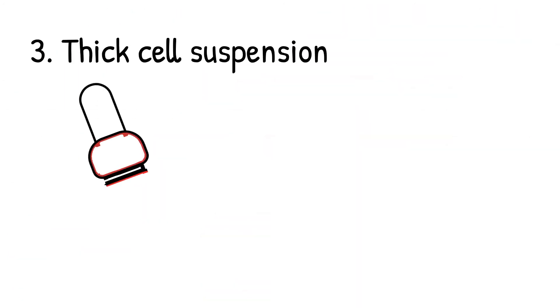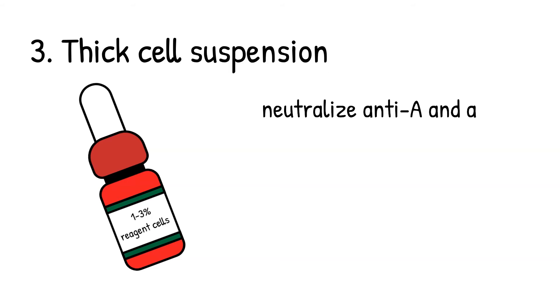We can also see this in bone marrow and stem cell transplant patients. Third, thick cell suspensions. Thick cell suspension can neutralize anti-A and anti-B typing reagents. We can solve this by making a new cell suspensions and making sure that the cell suspension is about three percent.